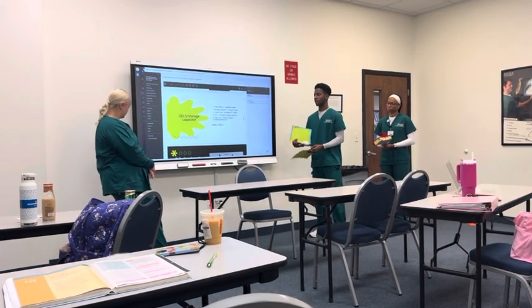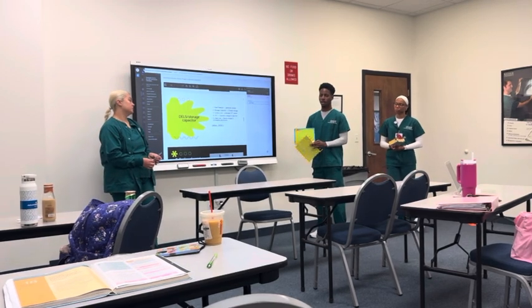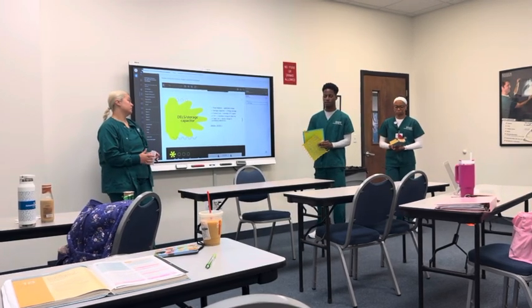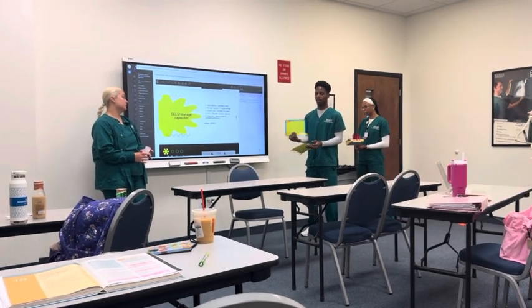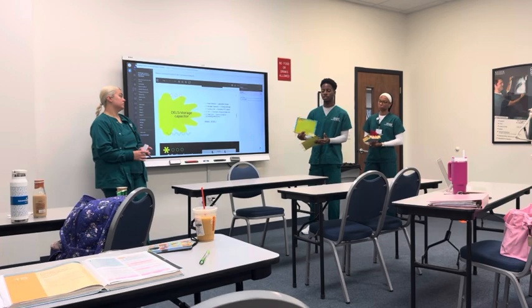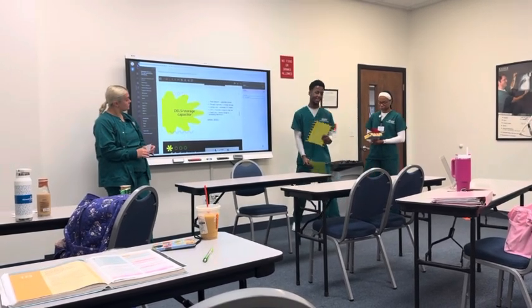If the storage capacitor fails, it can cause missing rows, columns, and distortion on the final image. And if there are too many failed storage capacitors, they usually replace the whole matrix. And yeah, that's it.